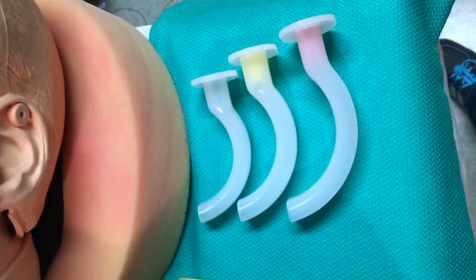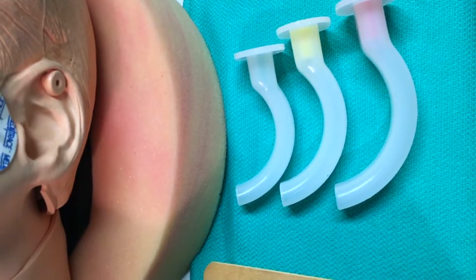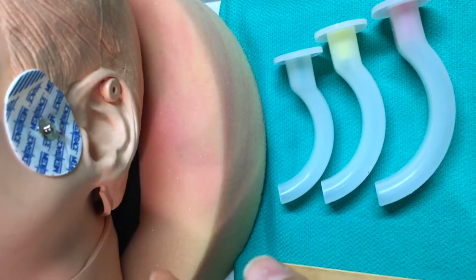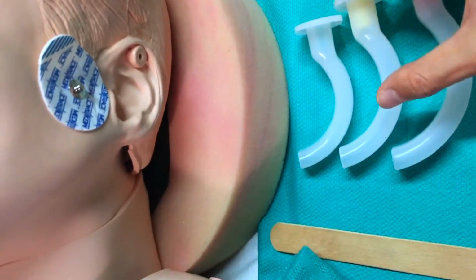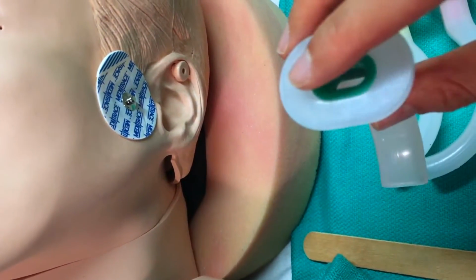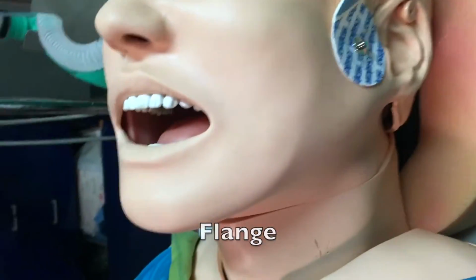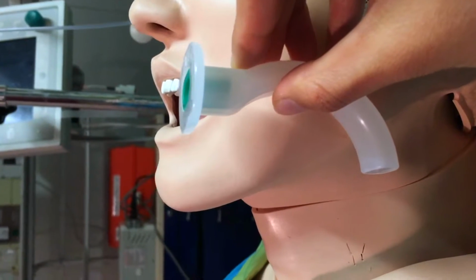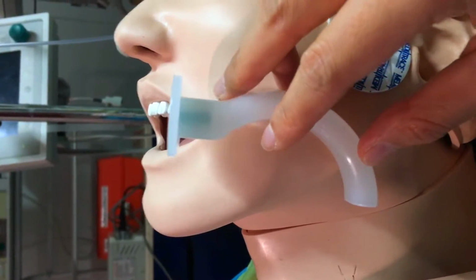So I'm going to show you the best way to figure out what size by measuring it on the mouth and the mandible. What's best is, this is called the flange, you want this at the outer border of the mouth, kind of like measure it like here, and then you want the tip to be kind of to the angle of the mandible but not past it.